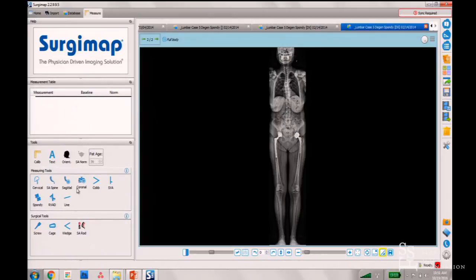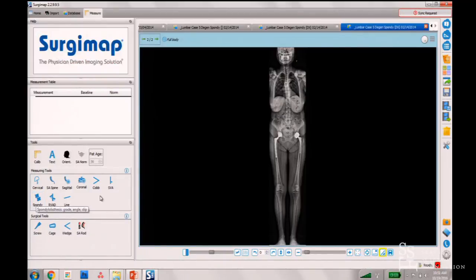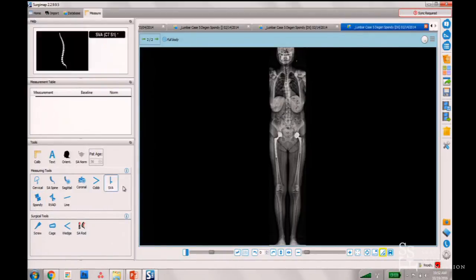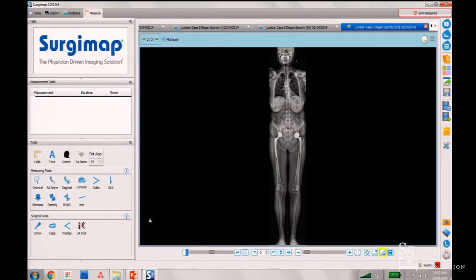Additional features include measurement of spondylolisthesis — grade and focal kyphosis. You can also measure a surface area, for example for stenosis, measuring the size of the spinal canal or a muscular area using the stenosis tool. Then you can simulate surgery using cages, osteotomies — including just facet resections — and simulate instrumentation such as a custom rod.